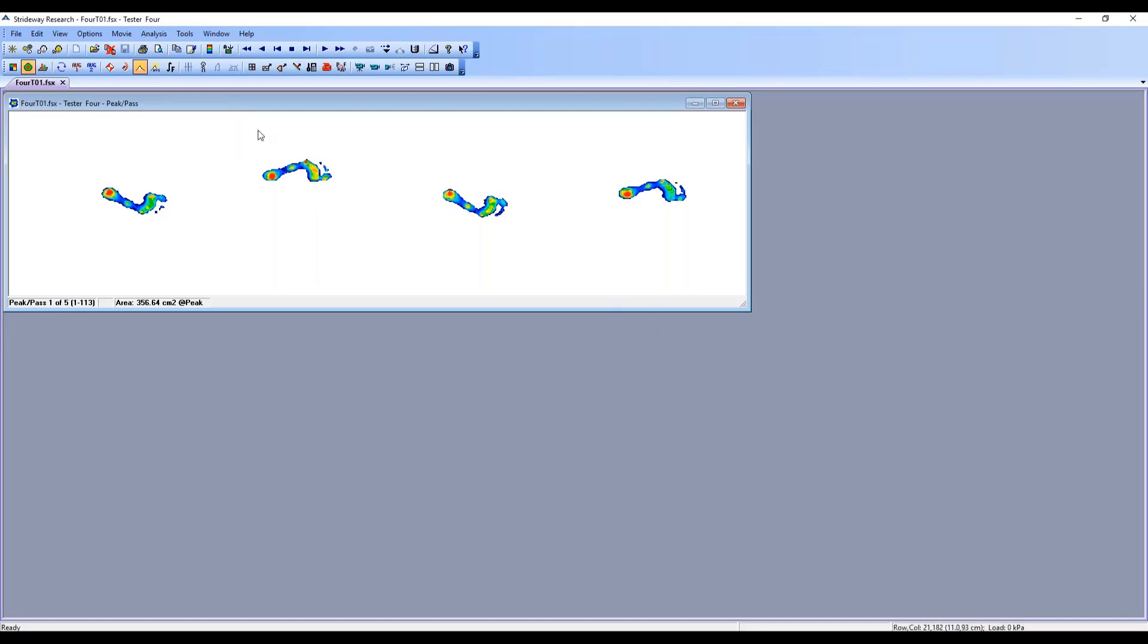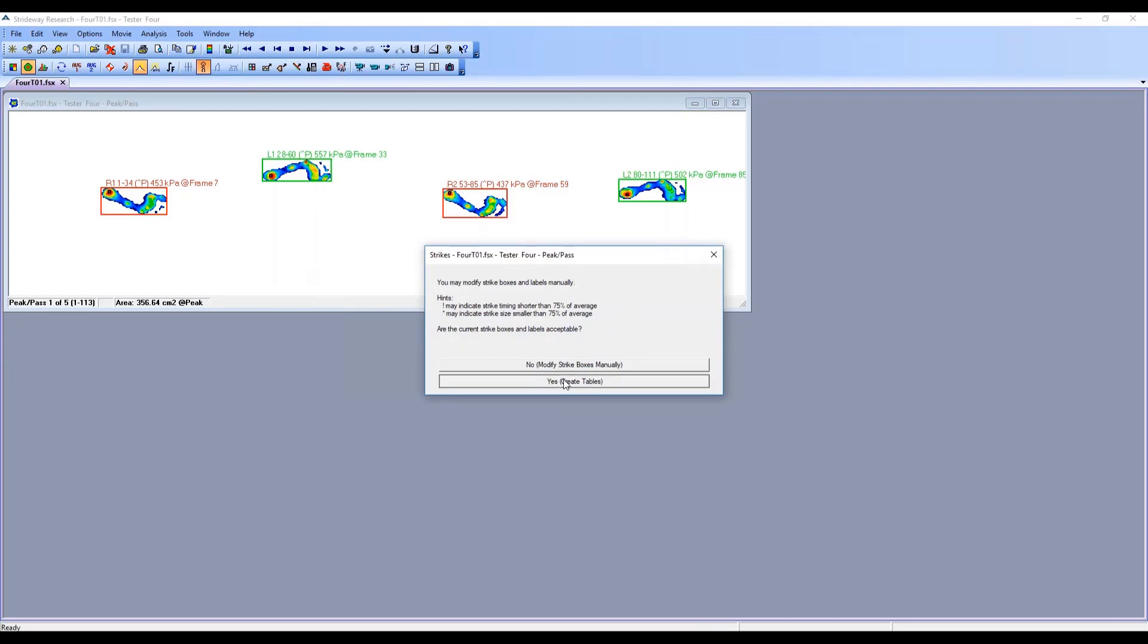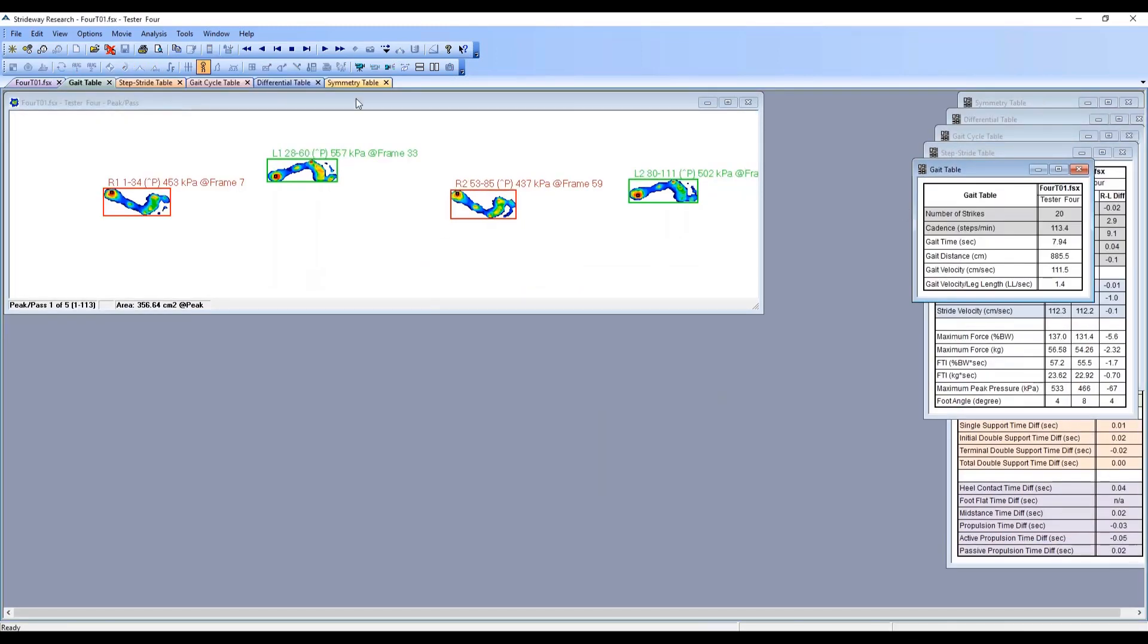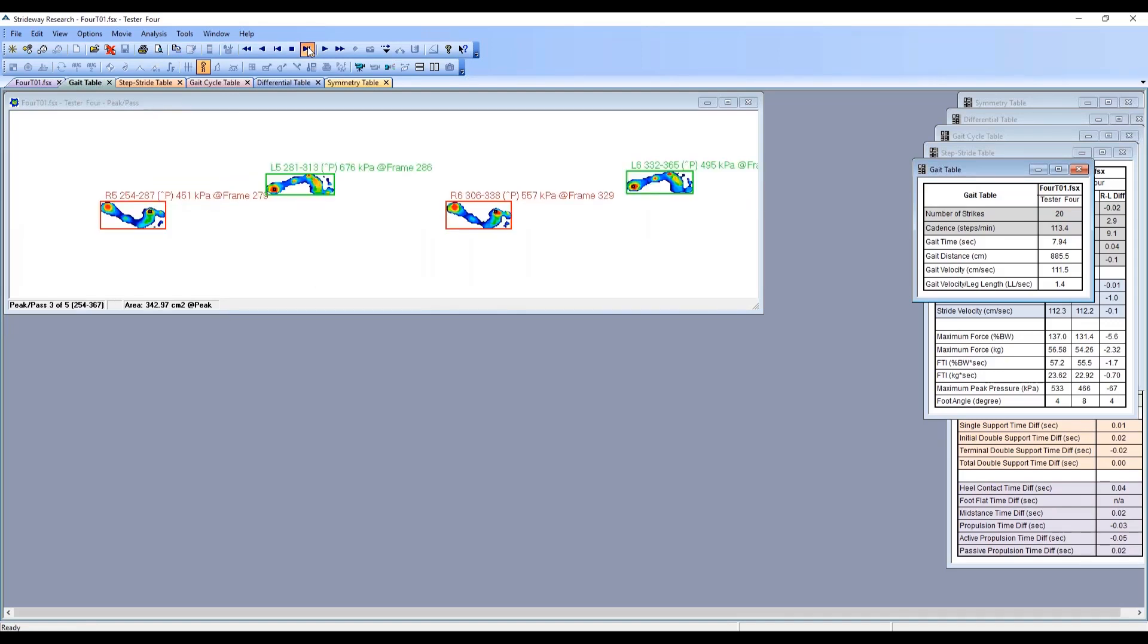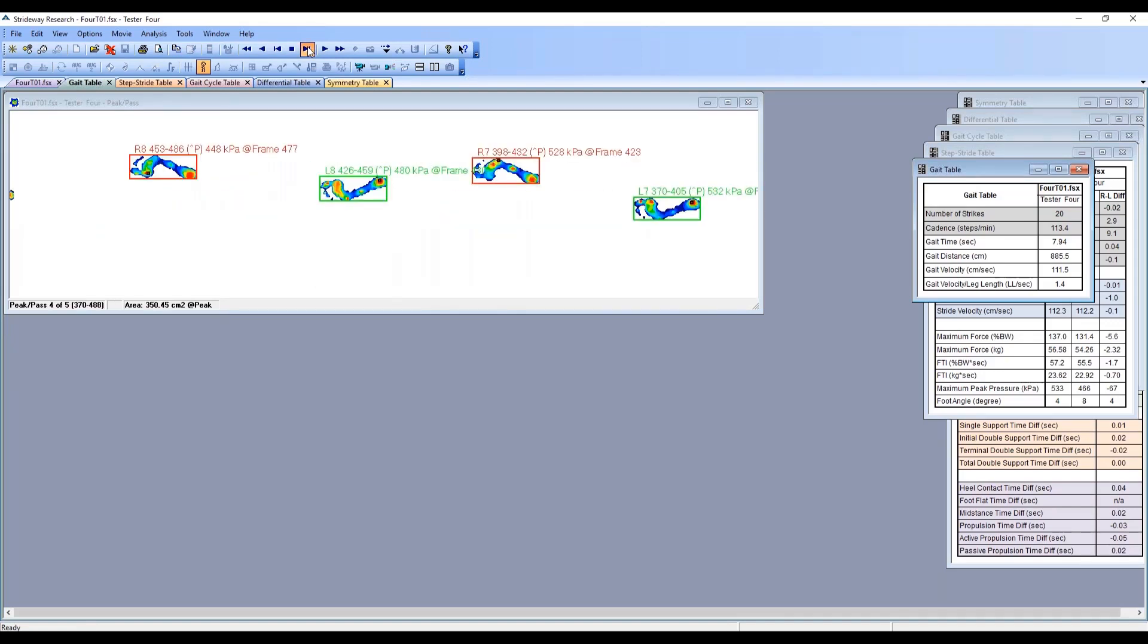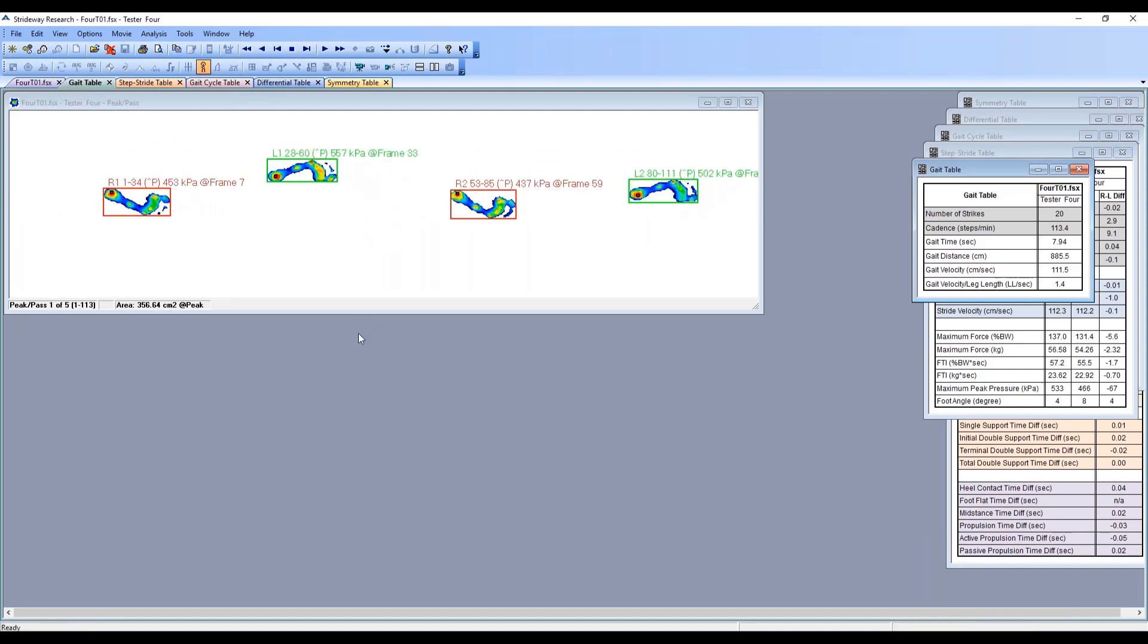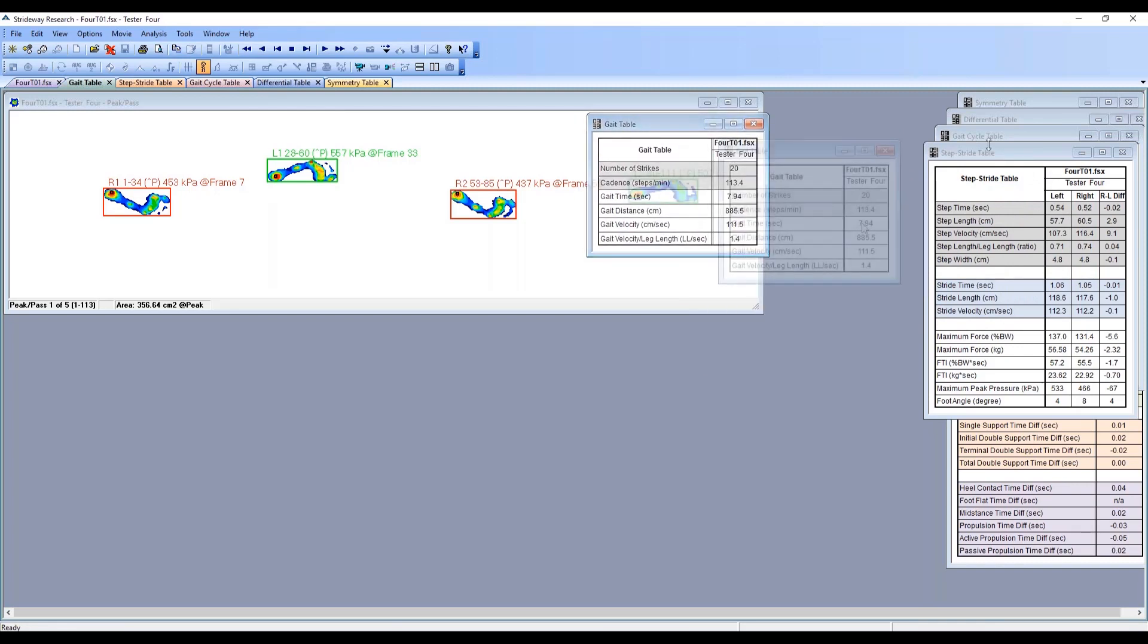The first step, assuming we've already made sure our foot strikes are okay, is to activate our human gait table and put the boxes down on the foot strikes. We'll quickly make sure everything looks good and that no bad foot strikes have been included. Once you've applied this and hit the human tables icon, the boxes will be placed and the gait tables will automatically populate.